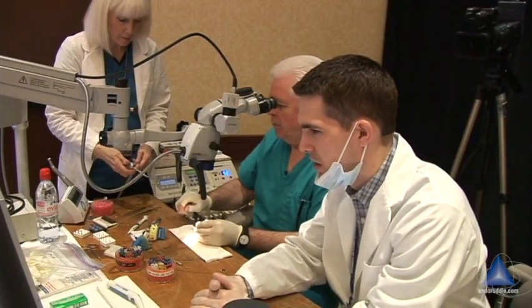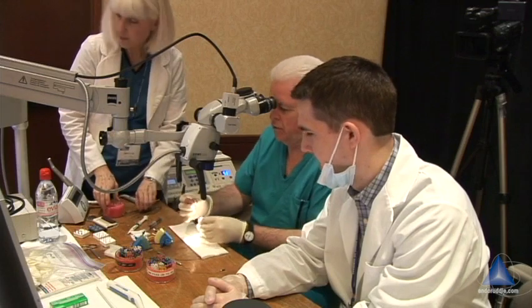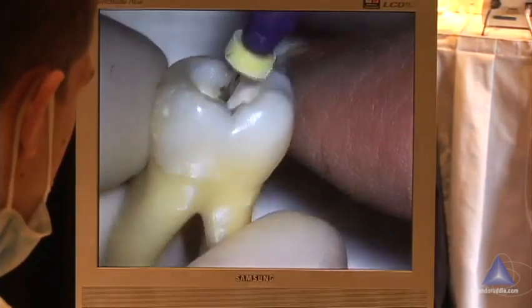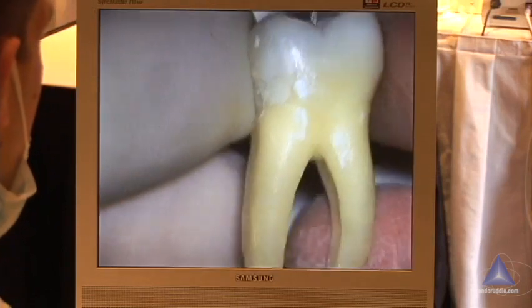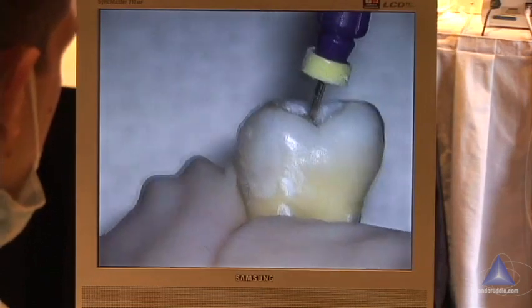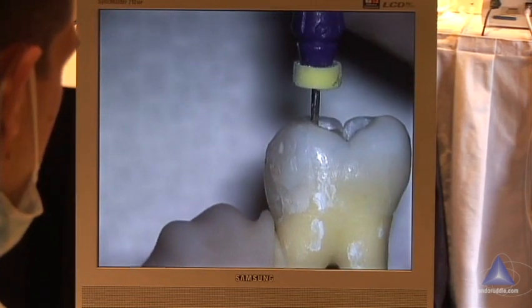Let's measure so we'll know what we did. Just throw this in. So it's a little off axis — it's not serious. You can't see the root clinically. So you would say based on the clinical crown, it's a little off axis and it maybe should go like that.